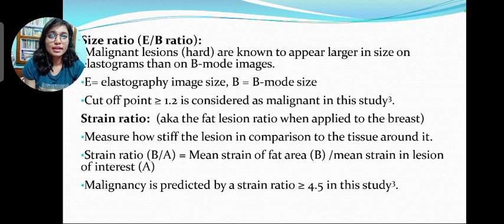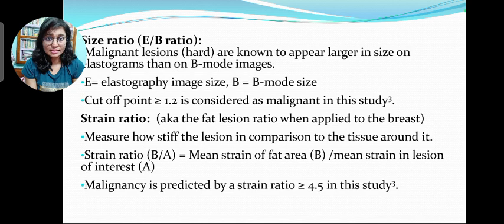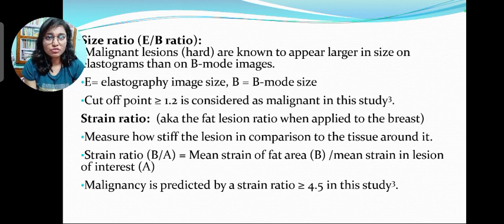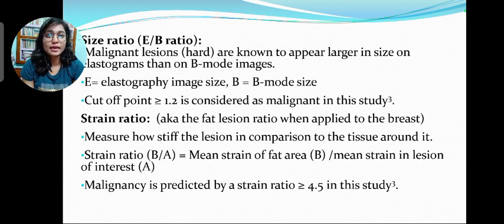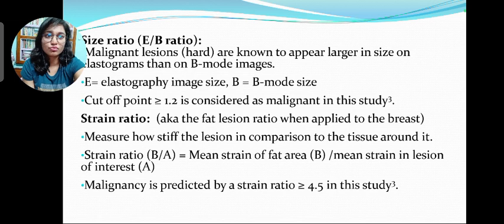Size ratio: malignant lesions are known to appear larger in size on the elastogram than on the B-mode images. It is calculated by dividing the elastogram image size by the B-mode size; a cut-off point of more than or equal to 1.2 is considered malignant in this study. Strain ratio, also known as fat lesion ratio when applied to the breast, measures how stiff the lesion is in comparison to the tissue around it. Strain ratio is measured by the mean strain of the fat area divided by the mean strain in the lesion of interest; malignancy is predicted by a strain ratio of more than or equal to 4.5 in this study.